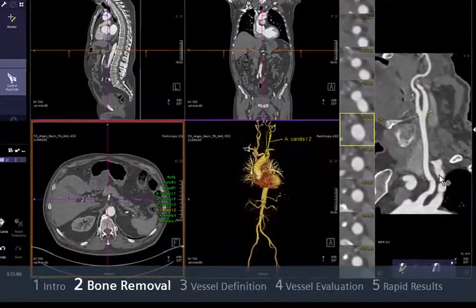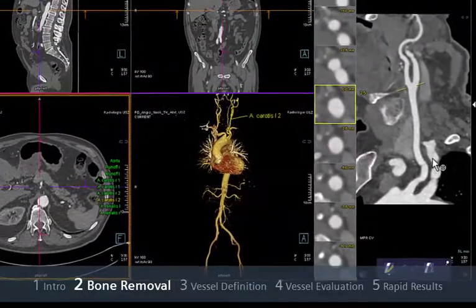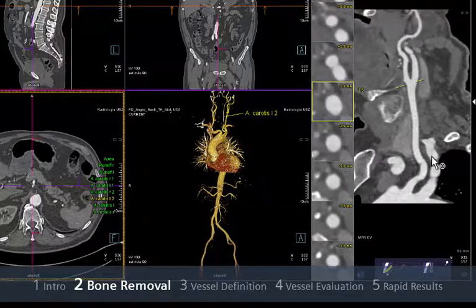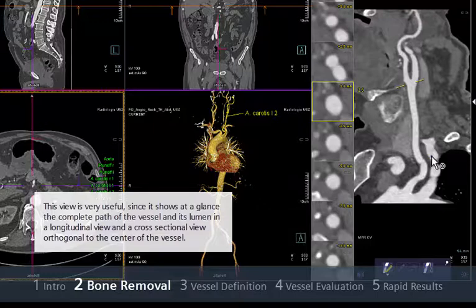The main vessels which have been automatically detected are labelled and displayed as a CPR on the corresponding segments, speeding up your evaluation. This view is very useful since it shows at a glance the complete path of the vessel and its lumen in a longitudinal view and a cross-sectional view orthogonal to the centre of the vessel.